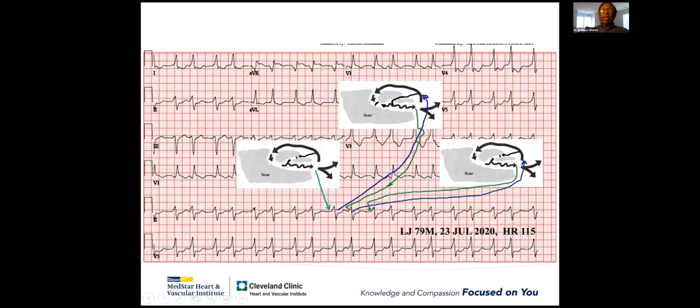The patient, fascicular VT is a possibility, right bundle left, or a scar near that area. Because fascicular VT will be a little narrower. This was 160 milliseconds. This is a little wider. And this patient has a history of MI with scar VT. We studied this patient. Can it be WPW with AF?